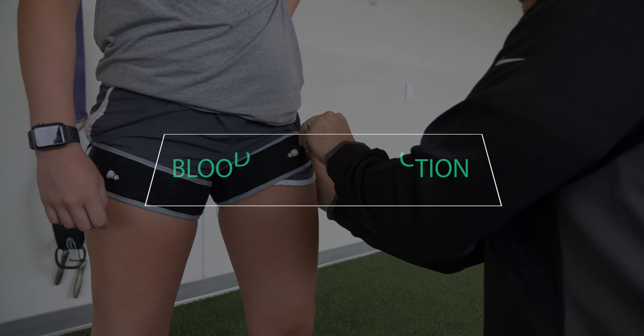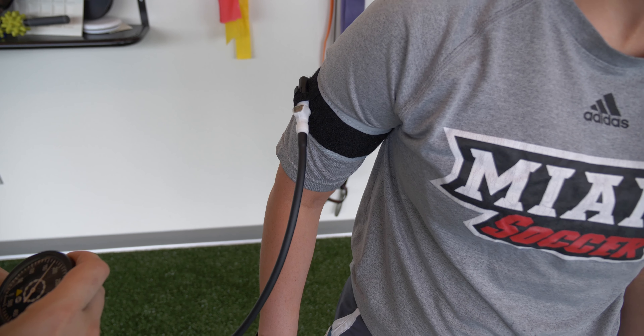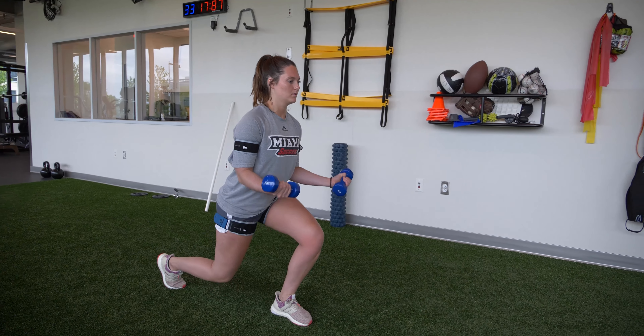Blood flow restriction is extremely useful for the post-operative and recently injured patient. After a surgery or recent injury, we often see significant muscle loss and weakness develop because of disuse. With blood flow restriction, we can start activating muscles and challenging them in a way that doesn't obstruct healing of the healing tissues, so that we can get maximal strength gains early on in rehabilitation.